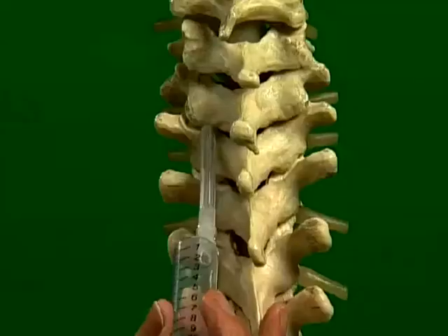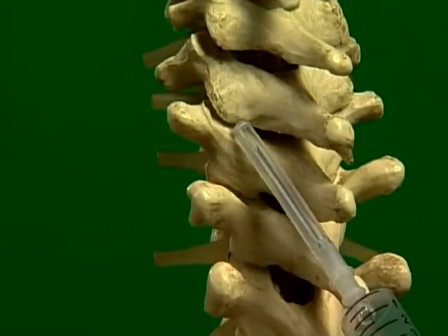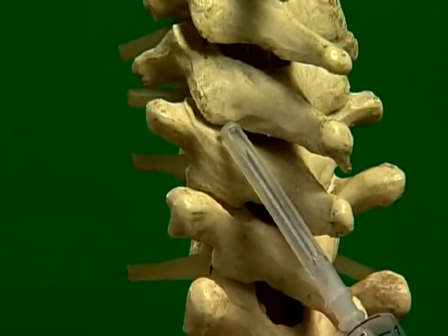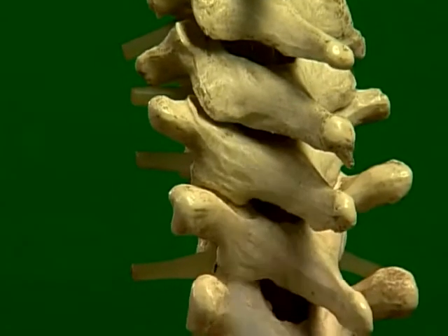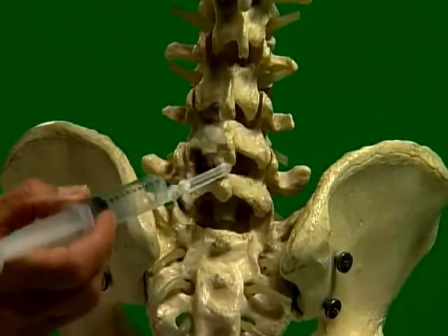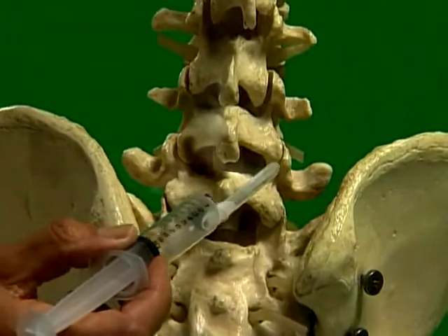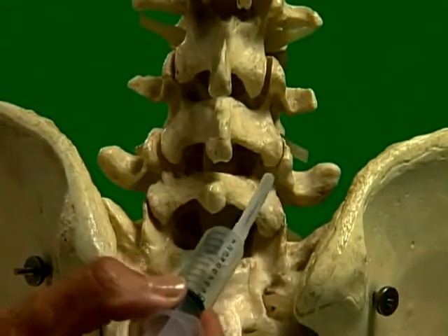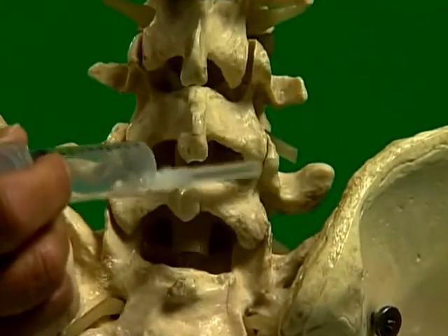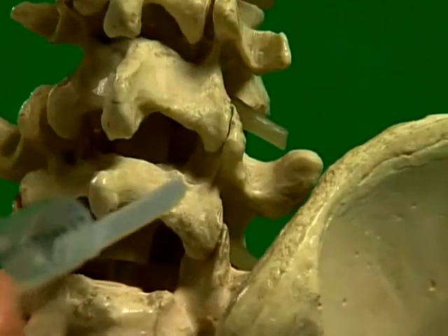Identify the tender facet joint lying about 1 finger lateral to the spinous process. The needle enters at an angle of about 30 degrees. Localize the spinous process and the interspace between the two. 2 fingers laterally marks a point over the facet joint. A long spinal needle will pass down to touch bone at the back of the facet.